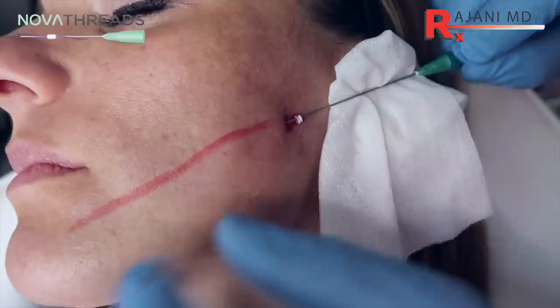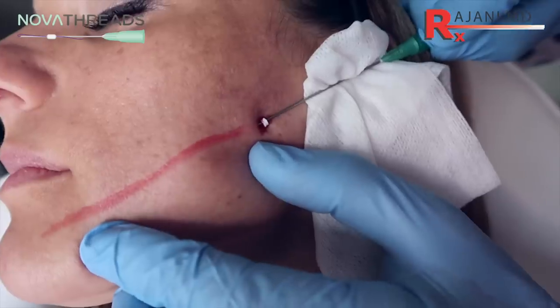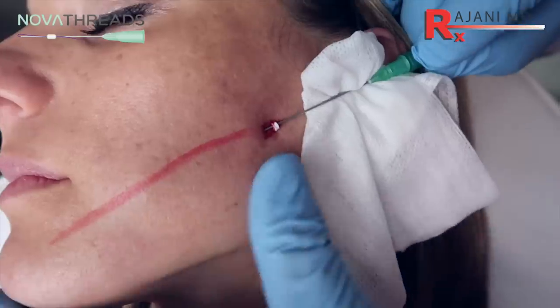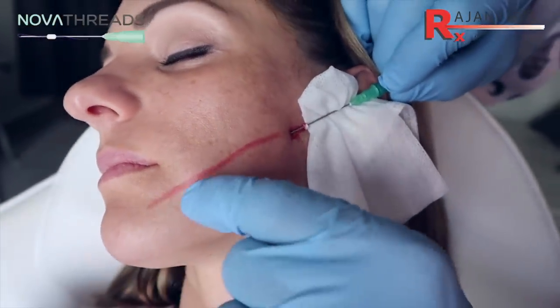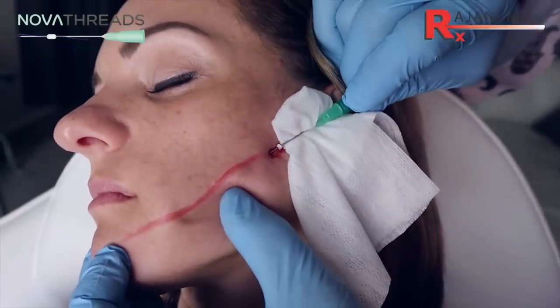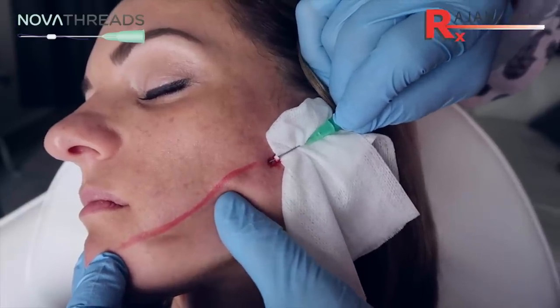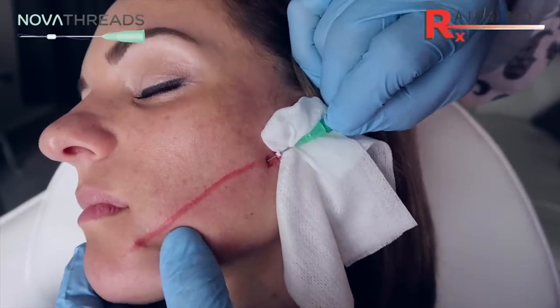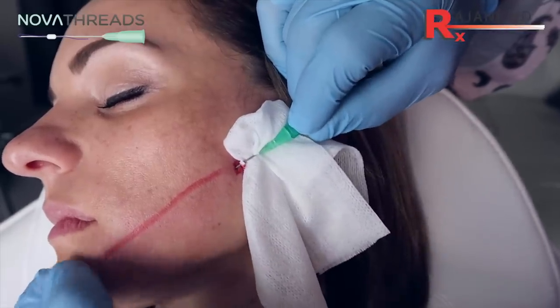Tension the tissue — there'll be a little pop right there. Now I want to be a little more superficial, so I push down on the cannula and traverse. You can see it traversing nicely in a nice plane. This is the area that can get a little bit sensitive, so we're careful here. Here's the fold — some people stop here, but I like to go through the fold. Tension the tissue, keep the same plane through the fold. It can be hard if the fold is deep — in this case it's not. It's a little tender here and we don't see any evidence of that through the fold. We haven't used the whole thread, but you don't need to.